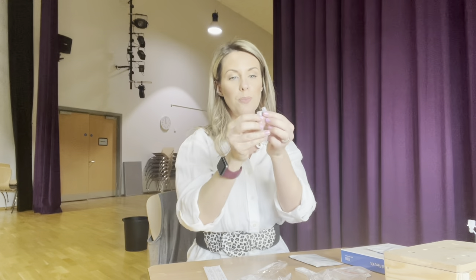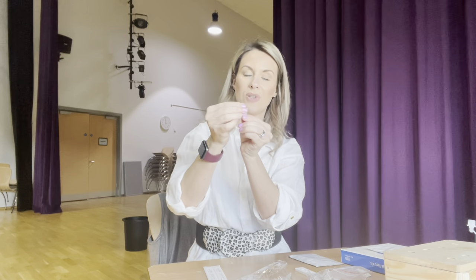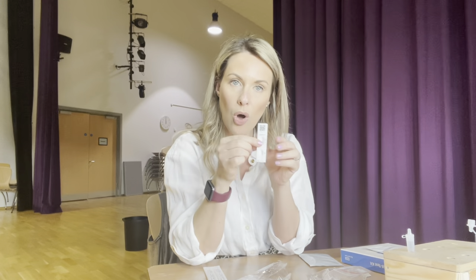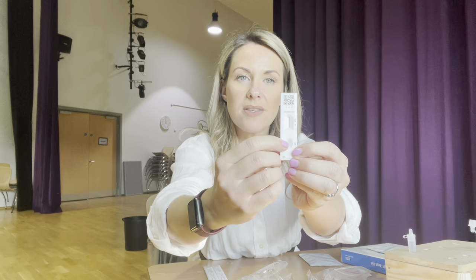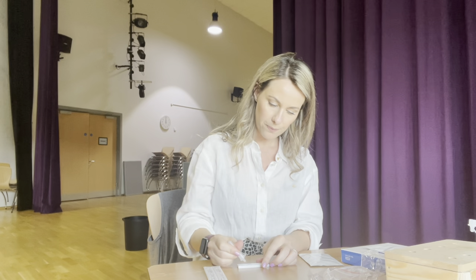Take your test tube and pop the top on so it's nice and secure. Then you're going to pop two drops of the liquid into the section where it says S. So two drops — make sure you've got a flat surface — one, two.